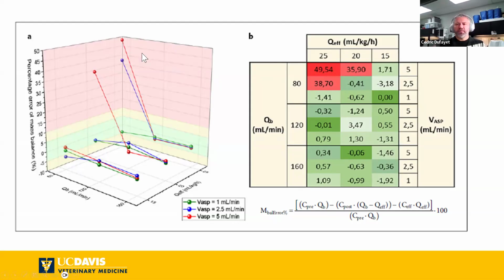And with the Carpe Diem that has even smaller filters and lower velocities, I wonder if that's just what happened to that particular colleague, because he was having actually a higher BUN in his post-filter sample than pre-filter. And I wonder if it's just the impact of aspiration velocity when he was taking the samples that could have explained that kind of situation.